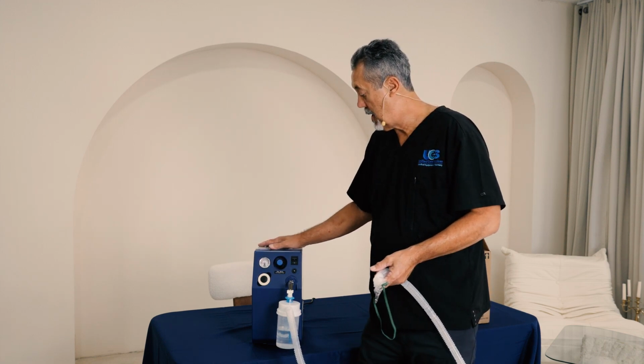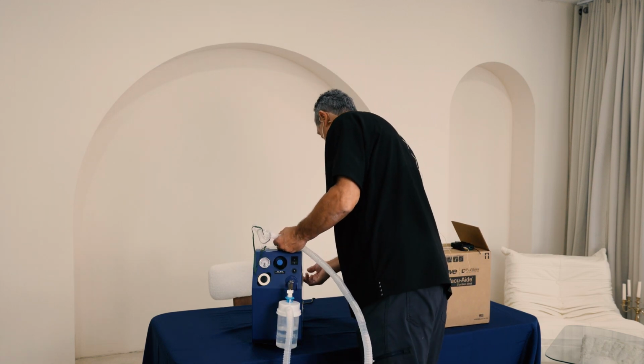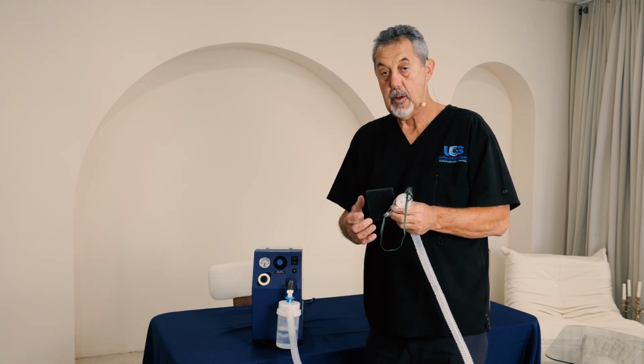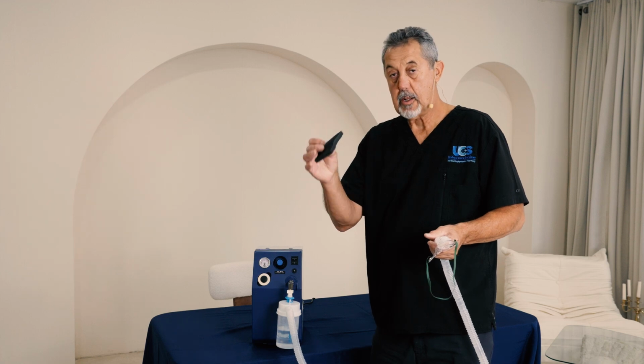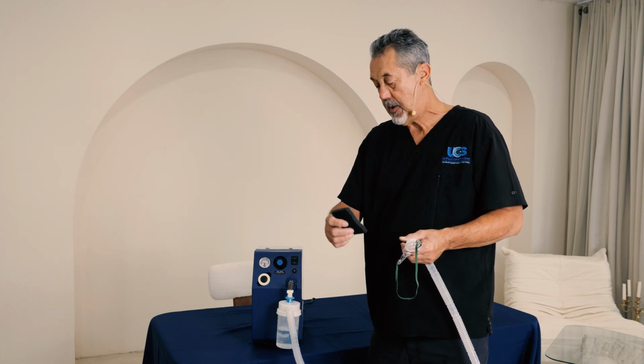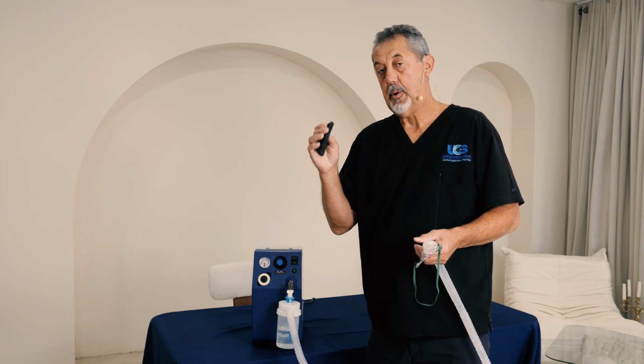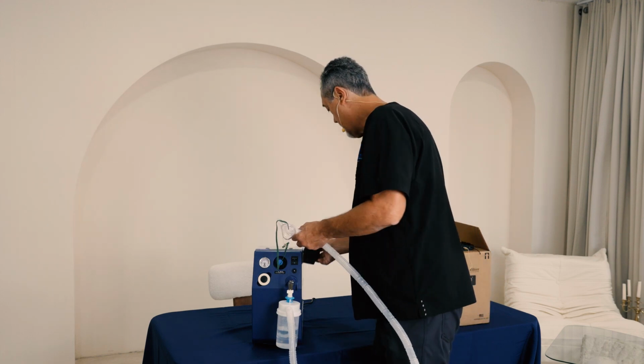On the back of the machine, you're going to have another filter. This is it right here. Dust will accumulate on one side. I recommend it on a weekly basis. If you use it every day, you take your filter out, you wash it, clean it, dry it, and put it back. So once a week.